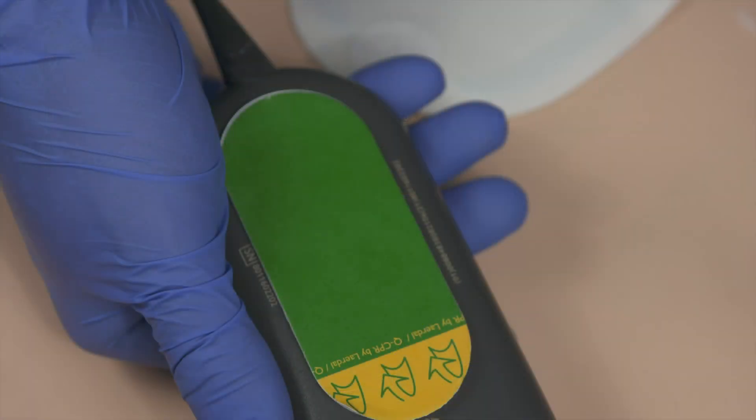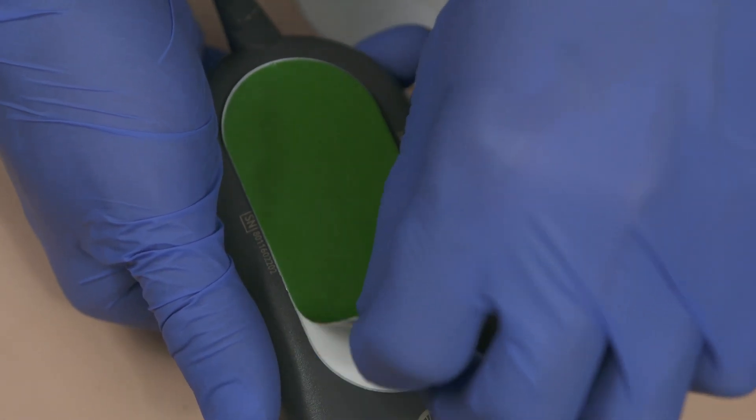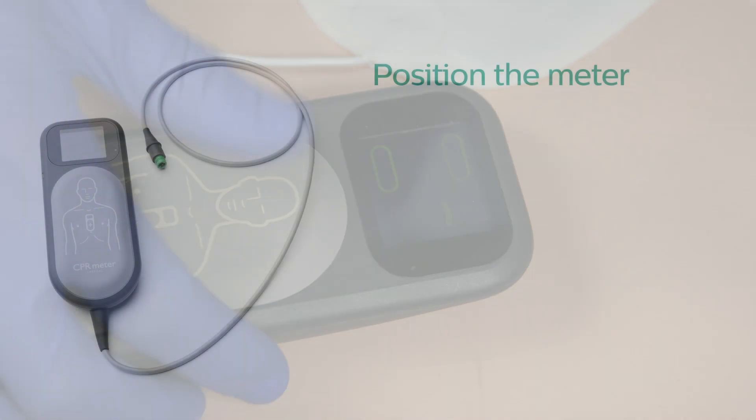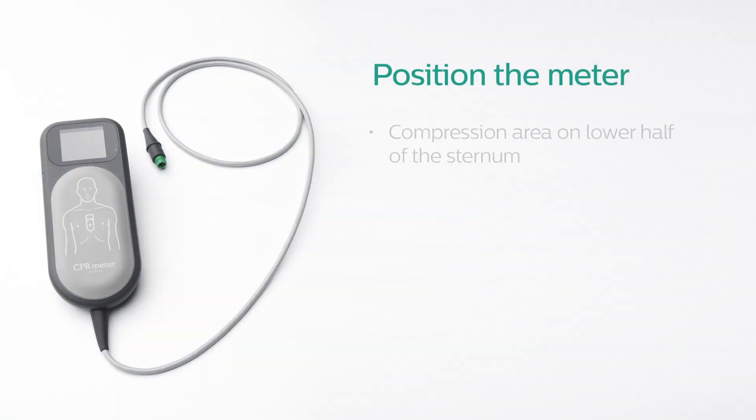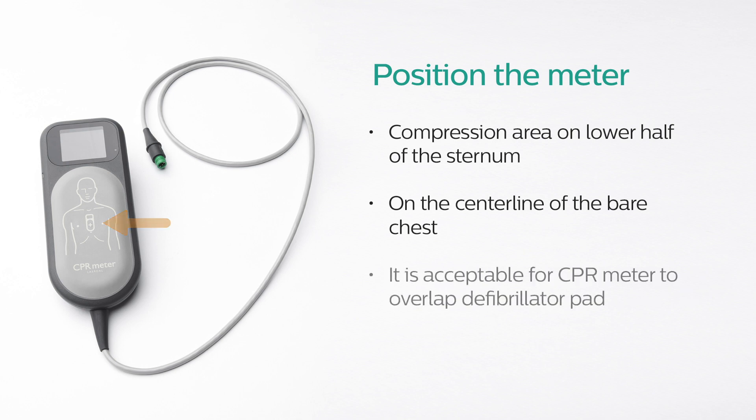To place the CPR meter on the patient, ensure the patient's skin is clean and dry. If necessary, clip or shave the hair from the sternum area. Peel off the green liner from the CPR meter adhesive pad to expose the adhesive surface. Position the CPR meter so the compression area is placed on the lower half of the sternum on the centerline of the bare chest, as illustrated on the front of the CPR meter. It is acceptable if the CPR meter overlaps the defibrillator pad.